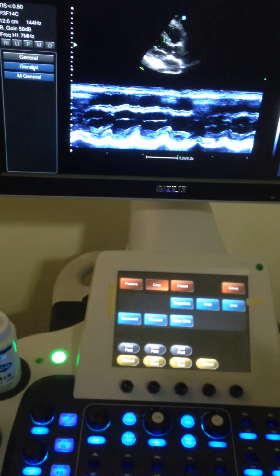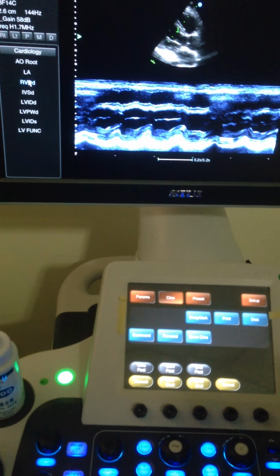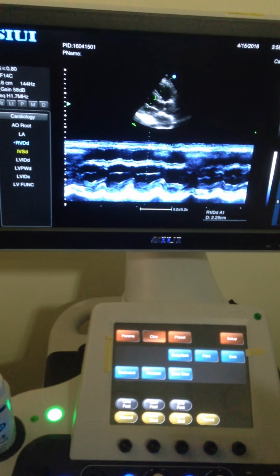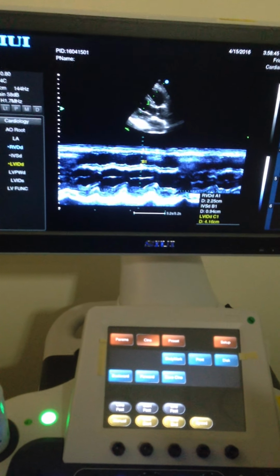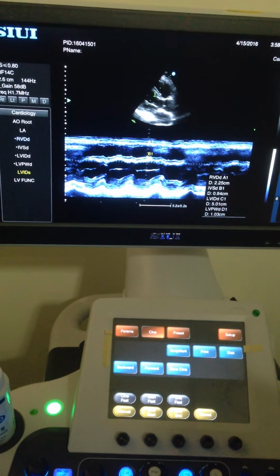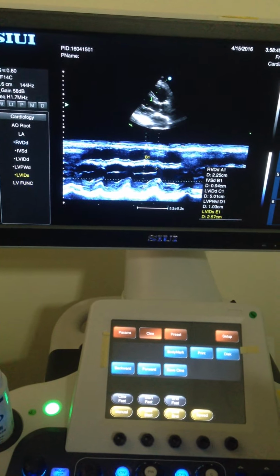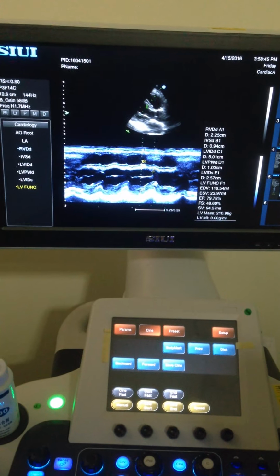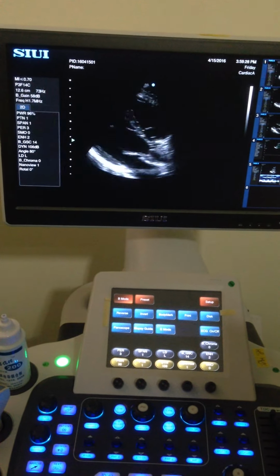It goes to the general cardiac measurement, and I will do the right ventricle measurement. Next, the septum, and the end of diastolic left ventricle, and then the posterior. The next will be the end of systolic measurement, and then you get the heart function as it comes out. Just save the imaging. This is an M mode measurement. And then I go back to the general normal study.